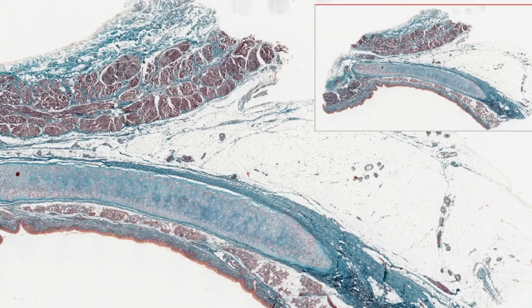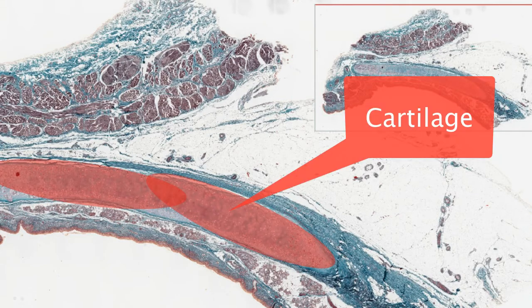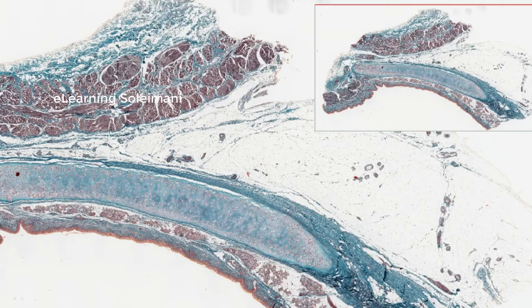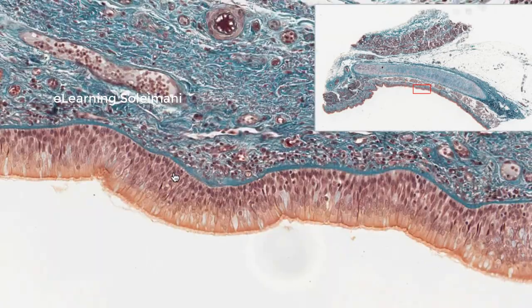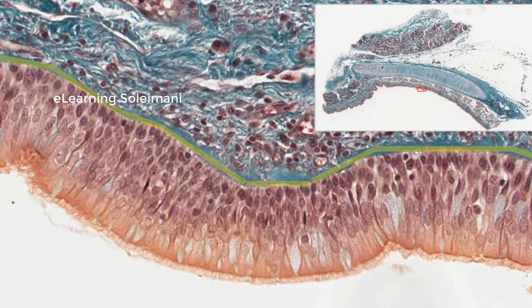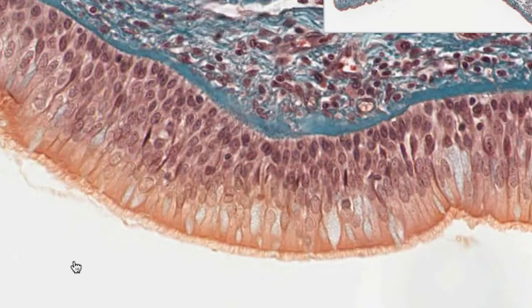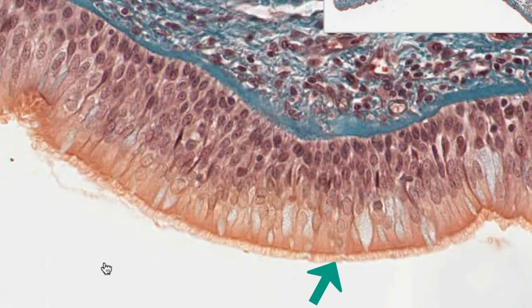The next slide is the trachea, which has a cartilaginous main structure. Its epithelium is pseudostratified ciliated epithelium. With further magnification, the basal membrane can be seen. Three types of cells can be observed: ciliated cells, goblet cells, and basal cells, with different lengths. Their nuclei are located at different levels, giving the impression of stratification.